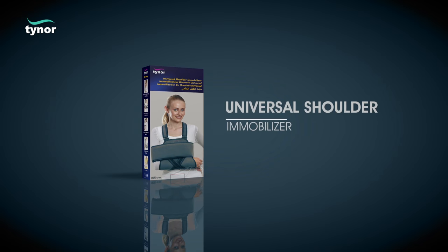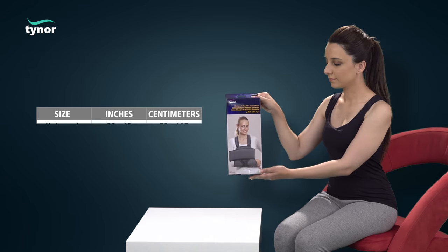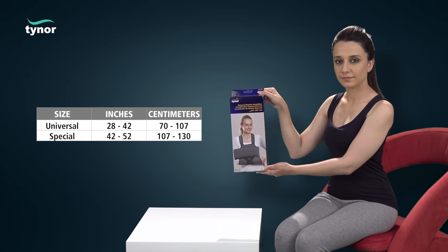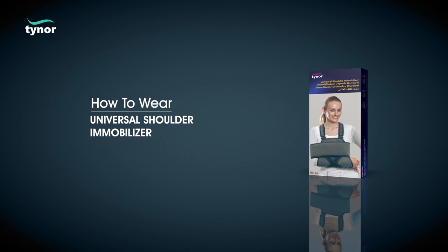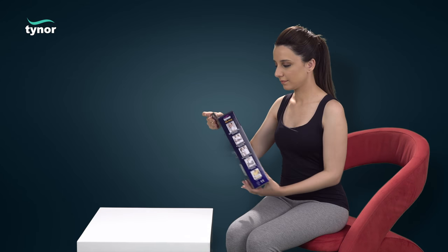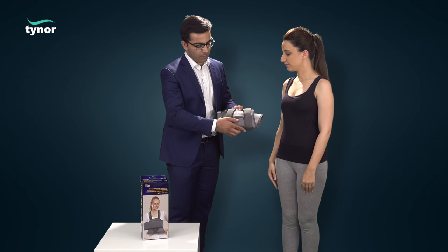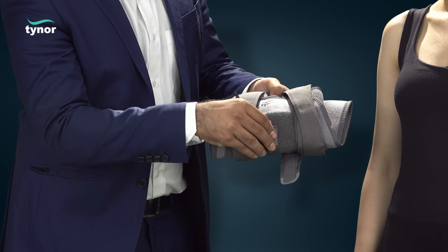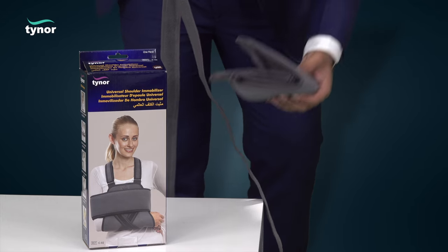Here we will discuss how to use the universal shoulder immobilizer. The universal shoulder immobilizer is available in these sizes. To select the correct size, measure the circumference around the chest. Now let us see how to wear the universal shoulder immobilizer.